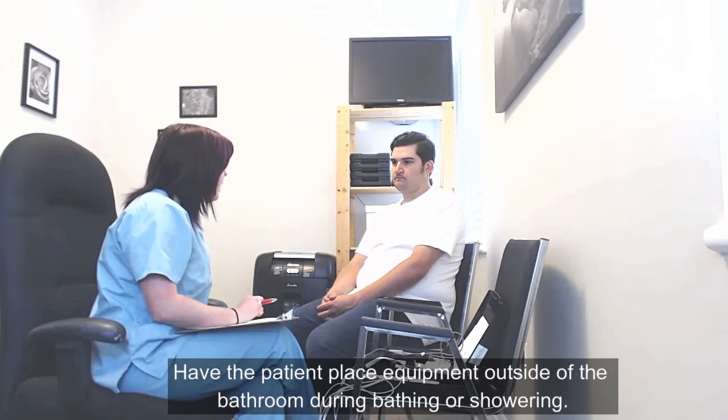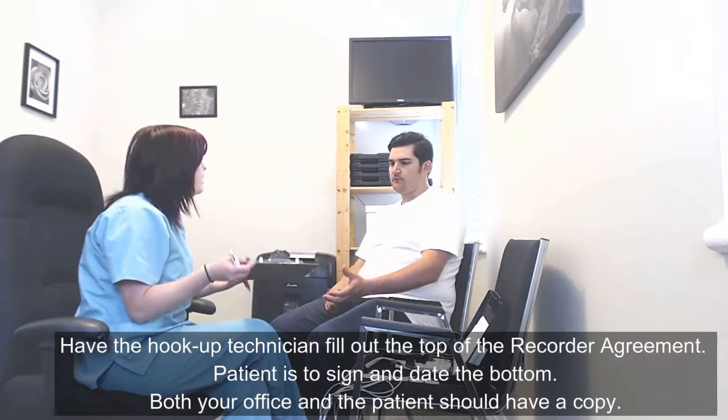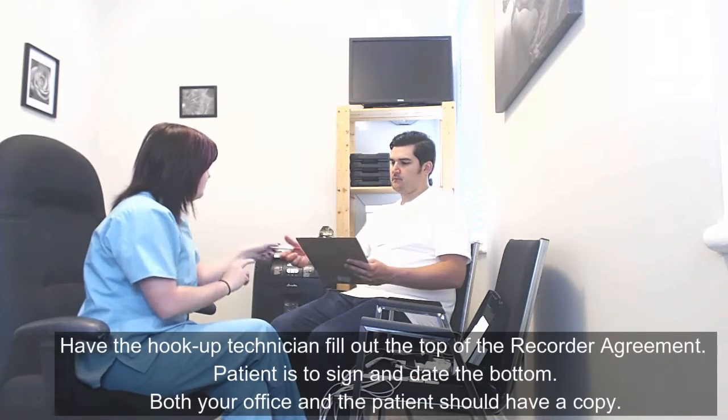Keep the machine outside of the bathroom when you are showering, because the steam can get to it as well. We will get you to read over this agreement here, just sign and date the bottom, and you will get a photocopy of this to take home.